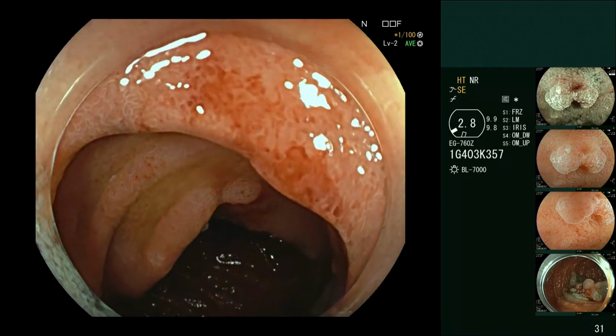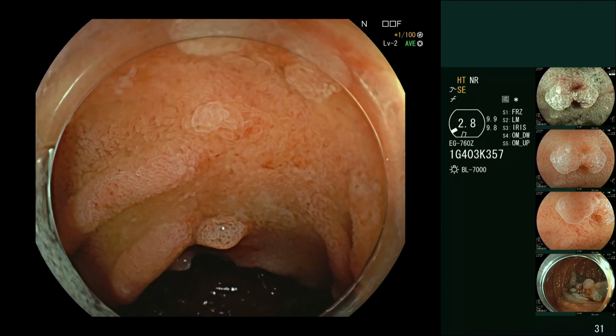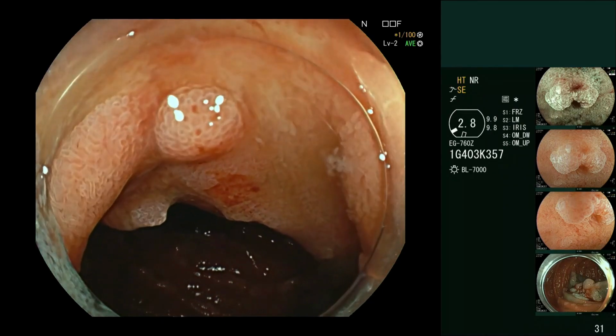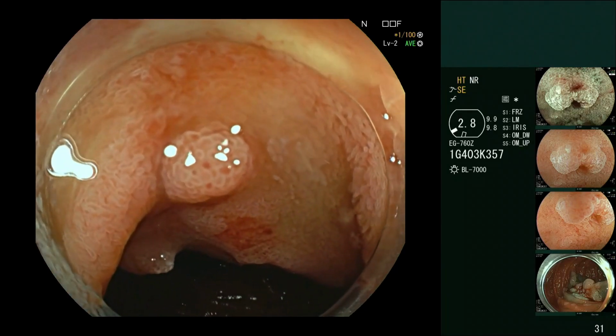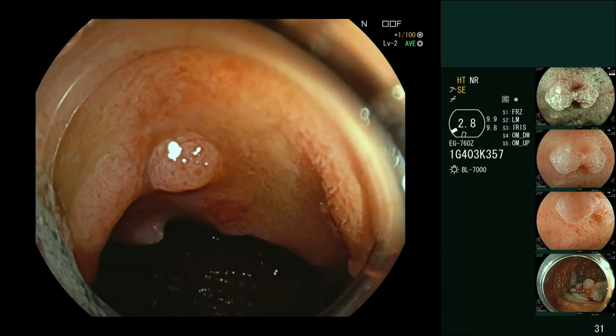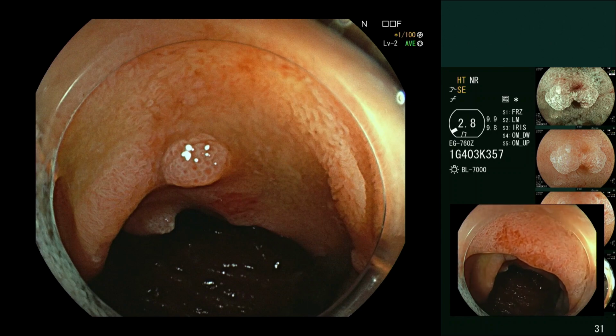And you need to know your orientation, so you need to get good at practicing that, and then you need to go slow, and probably sometimes you need to use water. So we saw it just under the lip there, for sure. You might be thinking, well, what are all these other nodules and why is it so flat here? So this patient has had a resection of an ampullary laterally spreading lesion, I think, not just an ampullary lesion, which extended down here. So now directly ahead in the paused image, you see a little nodule of regenerative mucosa, probably not polyp. And then you see a scar, and a scar is where that fold coming in from the 9 o'clock stops. There's nothing, and then the fold restarts at the 3 o'clock.